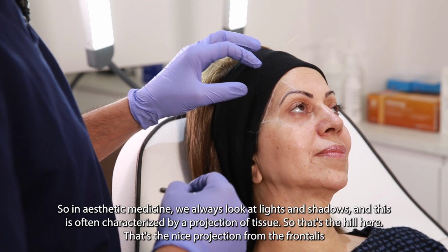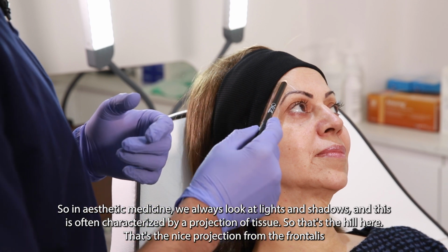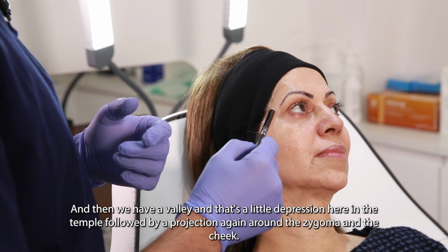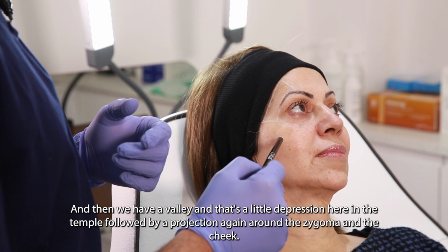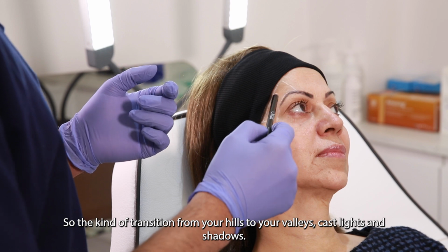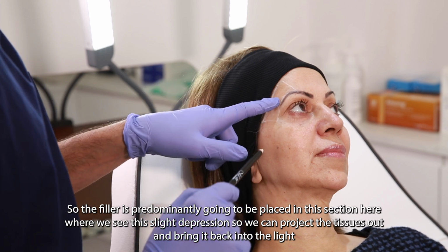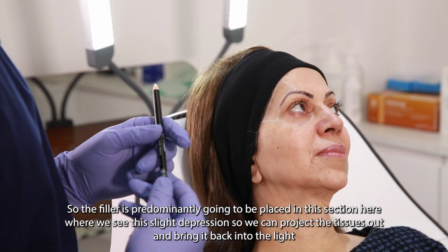So in aesthetic medicine, we always look at light and shadows, and this is often characterized by a projection of tissue. So that's the hill here, that's a nice projection from the frontalis. And then we have a valley, and that's a little depression here in the temple, followed by a projection again around the zygoma and the cheek, and there's your hill. So the kind of transition from your hills to your valleys casts lights and shadows. So our filler is predominantly going to be placed in this section here, where we see this slight depression, so we can project the tissues out and bring it back into the light.